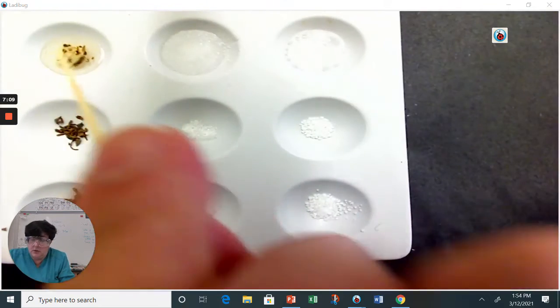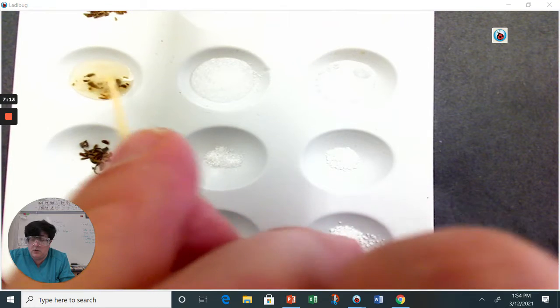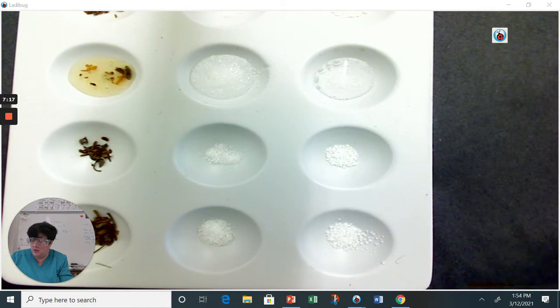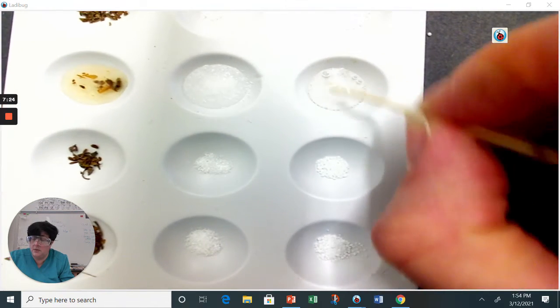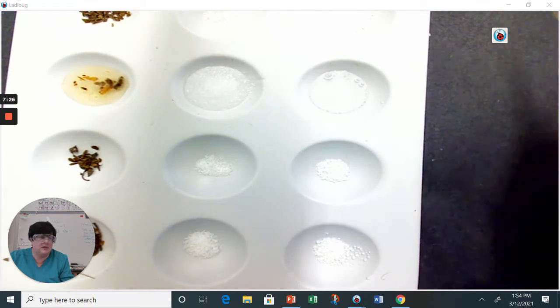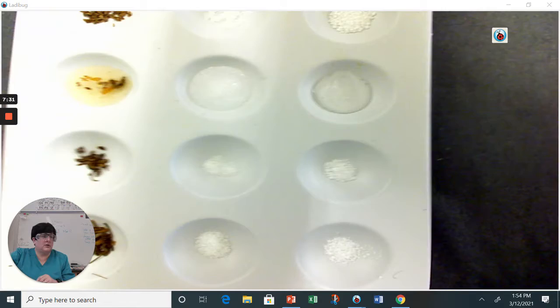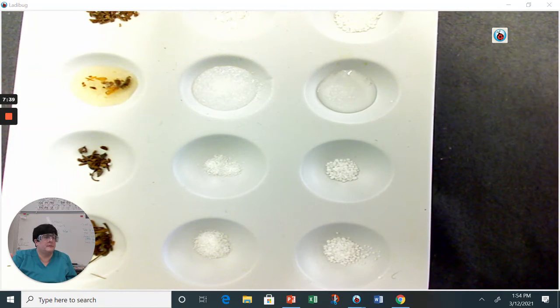So you do see a little bit of the vegetation seeping into the HCl color-wise. It's not a clear liquid. It's turning a little yellowish green there. And this bubbled. Ooh, and if I mix it, it keeps bubbling as more gets mixed into the liquid. I'll try to shadow that a little. This seems to be floating on the top with no reaction.